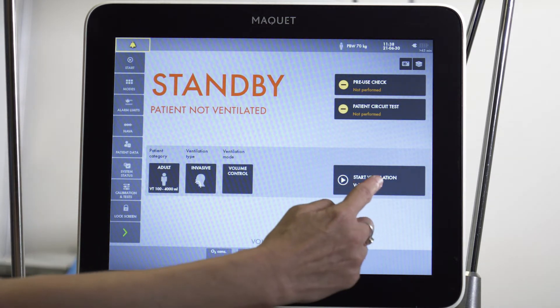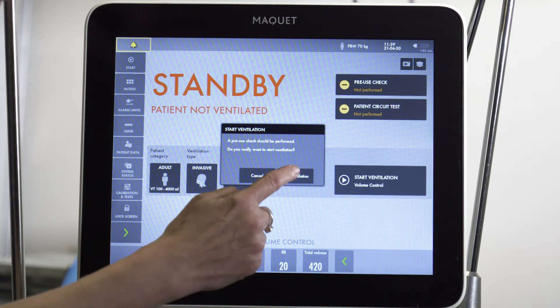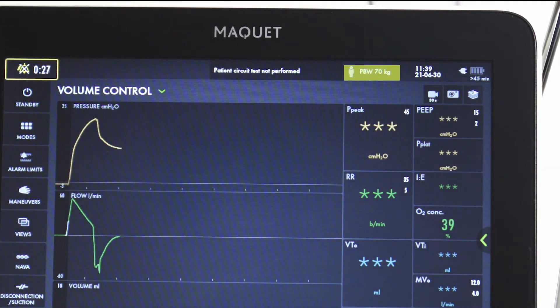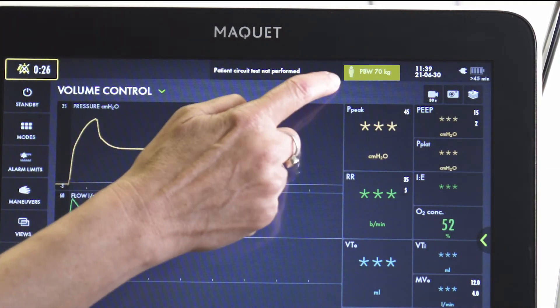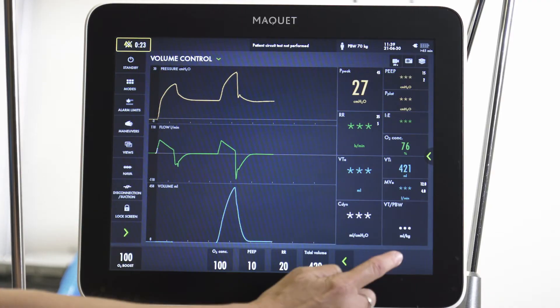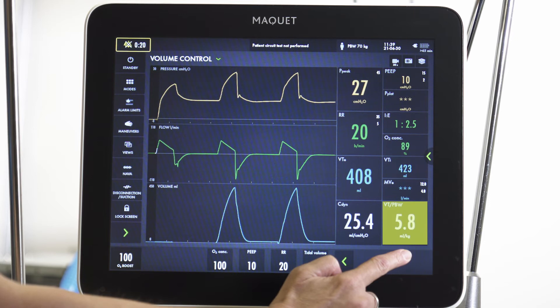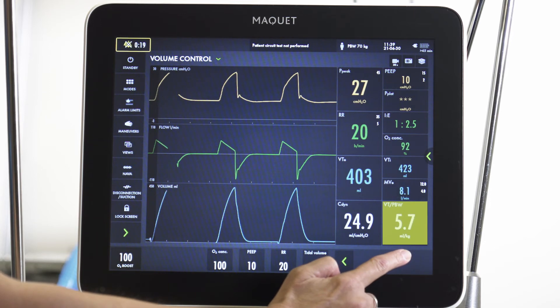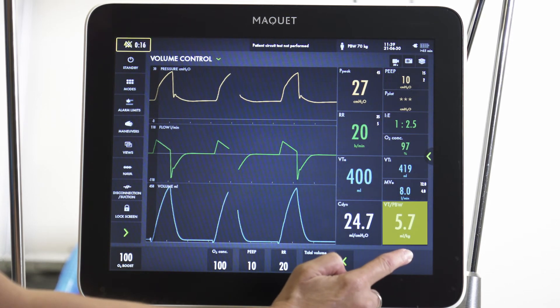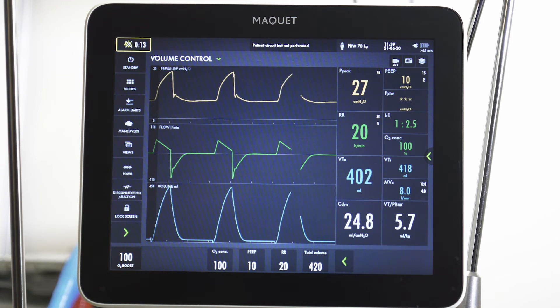Once we've entered these settings and we start ventilation, we can note in the upper right hand corner our predicted body weight, which then allows us to see in the lower right hand corner the dose and tidal volume that we're giving — which again should be about 6 milliliters per kilogram ideal body weight in order to use a lung protective strategy.